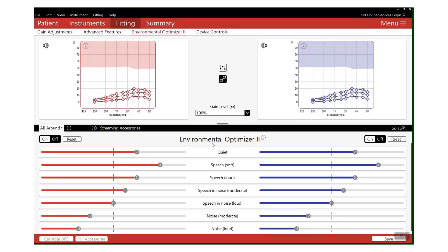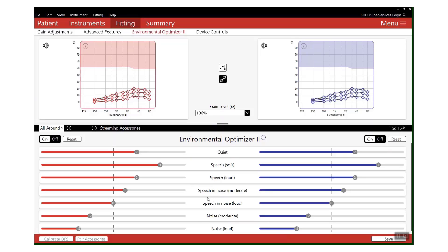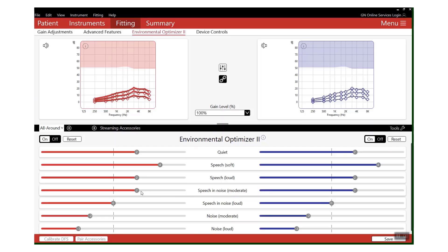You'll remember that we have those seven different categories that we classify into. Lucky for us, there's two speech in noise categories. So the first thing we're going to do is go to this gain handle where we've got speech in noise moderate and speech in noise loud, and we're going to increase the gain, maybe by only two or three dB, just enough to get that difference and a noticeable increase.